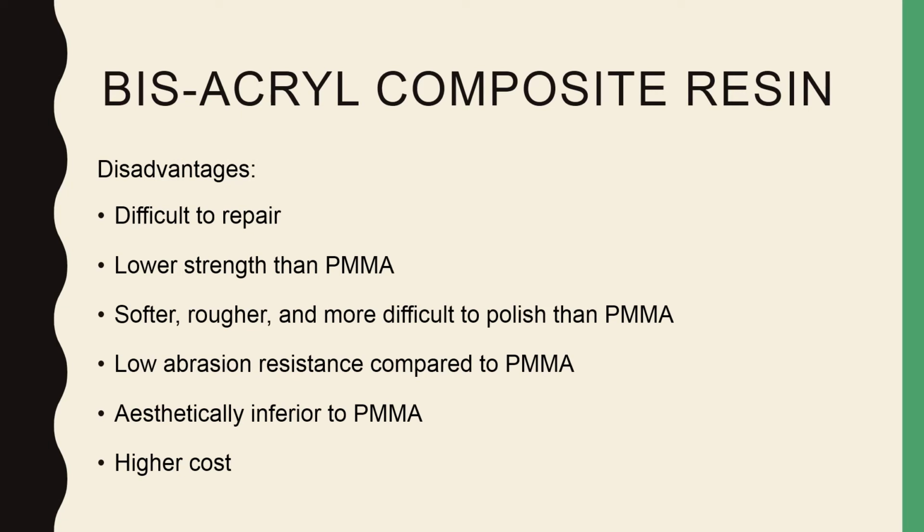While the disadvantages are, it's difficult to repair, have lower strength than the PMMA, and so it's used for single crown or short span bridges. It's softer, rougher, and more difficult to polish, has lower abrasion resistance, and is aesthetically inferior to the PMMA. It also has higher cost than the other materials.